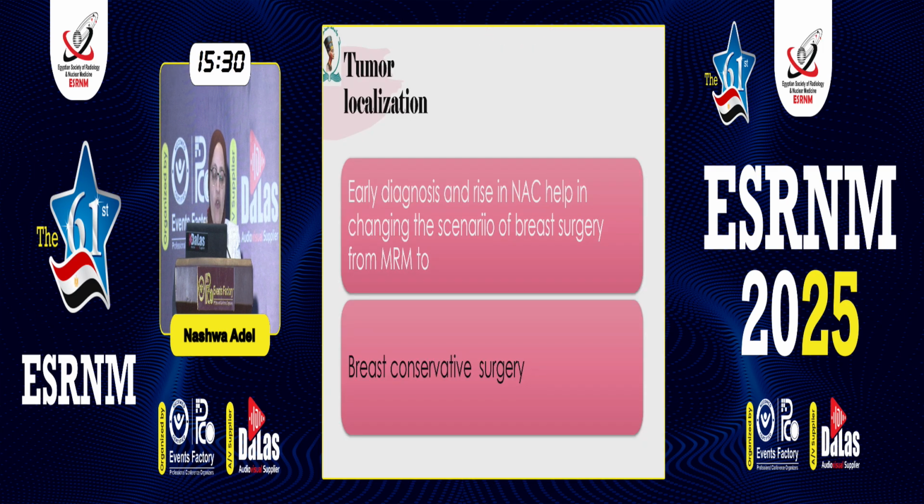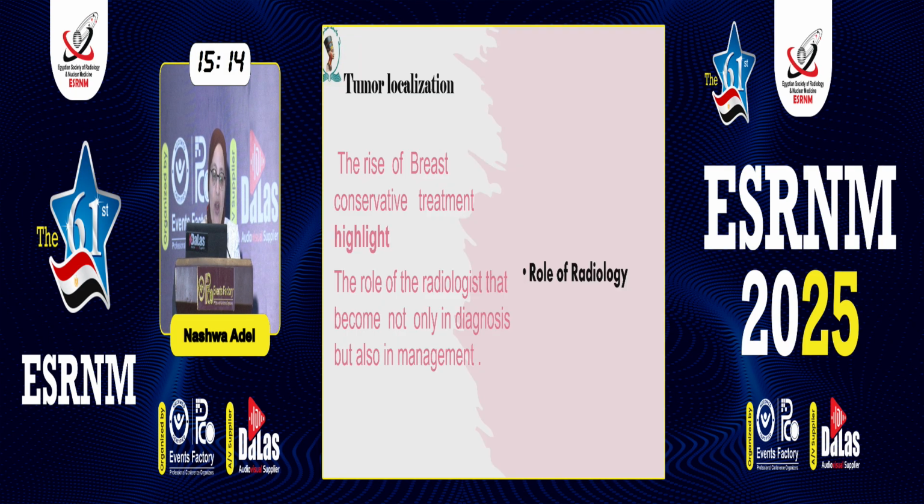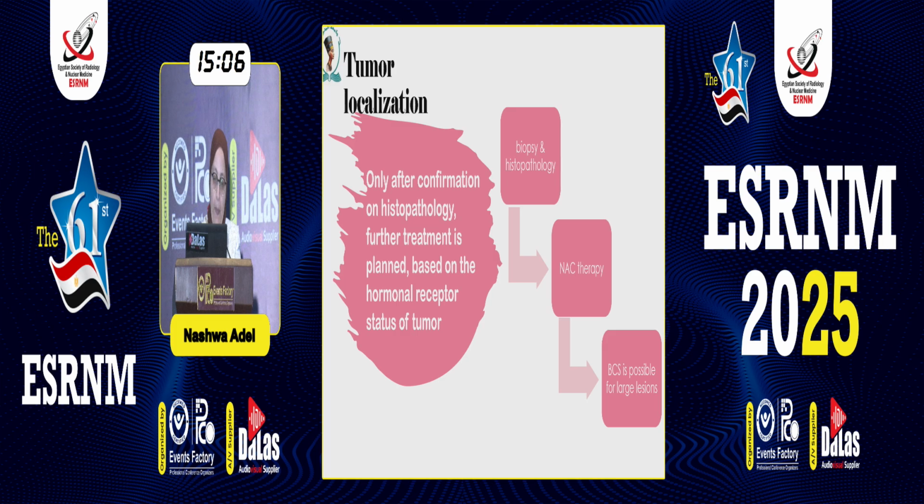Another type of breast intervention is tumor localization. Early diagnosis and the rise in neoadjuvant chemotherapy have helped change the scenario of breast surgery from modified radical mastectomy to breast conservative surgery. The rise of breast conservative treatment highlights the role of the radiologist, who becomes involved not only in diagnosis, but also in the management.